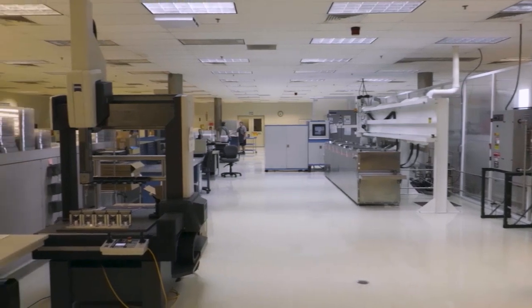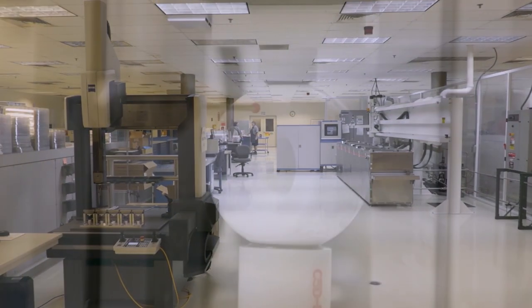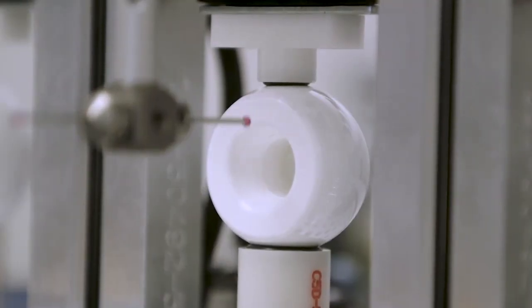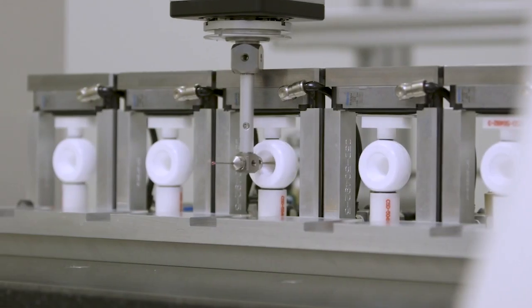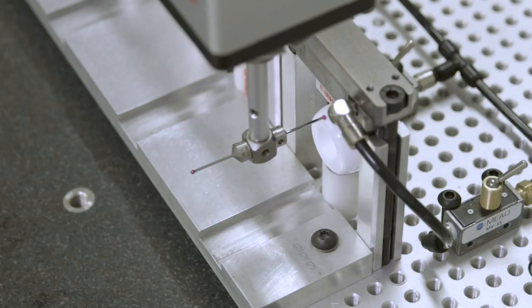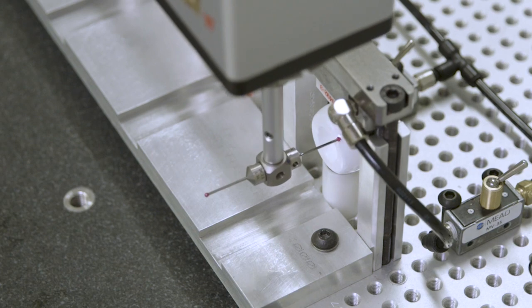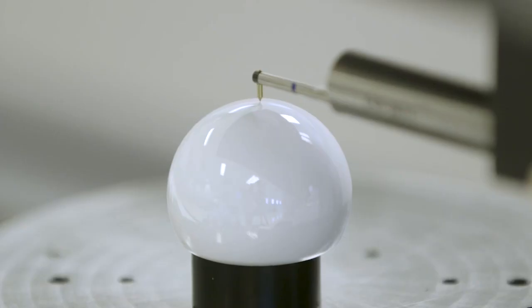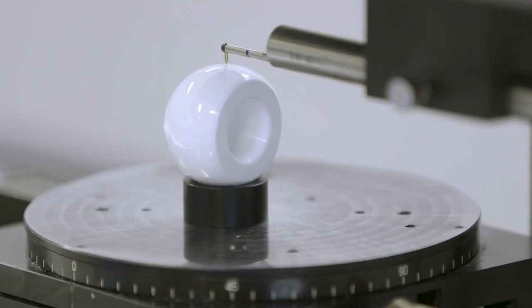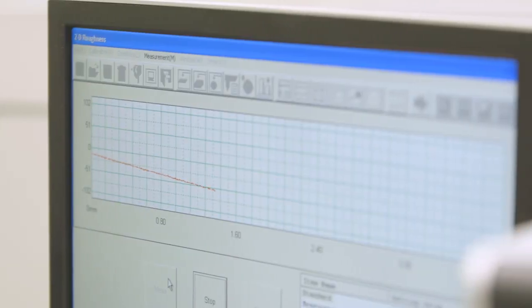The hip replacement component enters the final stages of production by going through a rigorous testing and quality control process. A ruby-tipped probe ensures the dimensions are to the exact specifications set by our customer. The surface is measured with a diamond tip to ensure proper finishes.